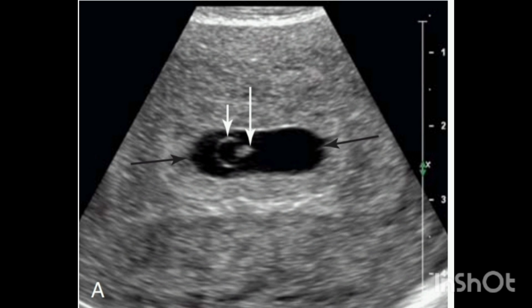To summarize, early ultrasound findings are vital for confirming the presence of a viable intrauterine pregnancy. The gestational sac marks the first sign, followed by the yolk sac and early embryo, which help us assess the health and progression of the pregnancy in its initial stages.